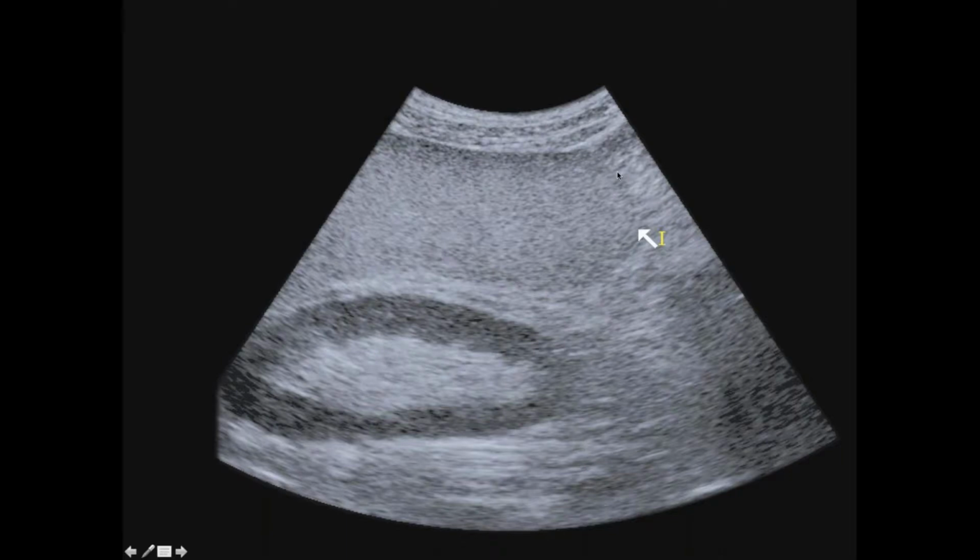You can see the right liver lobe with a rounded shape next to the arrow, and you can see some attenuation deeper to the kidney, and those are the important signs. Mainly it is echogenicity in comparison to the kidney.